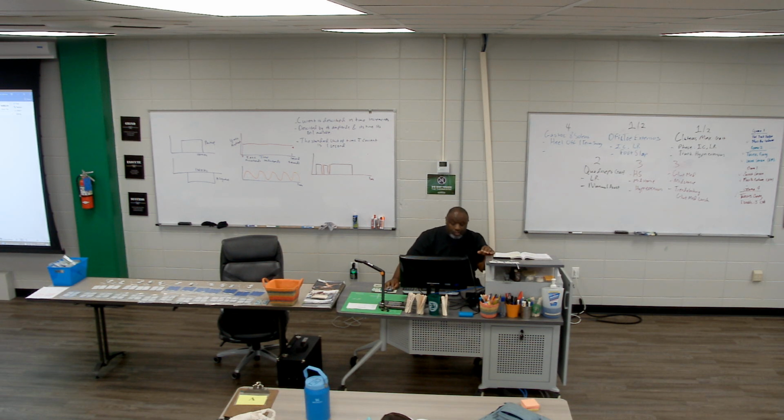Pulse currents, you'll see things like symmetrical biphasic, asymmetrical biphasic, or high volt pulse current, or VMS, variable muscle stim, or microcurrent. Any of those four are types of pulsed or pulsatile currents.